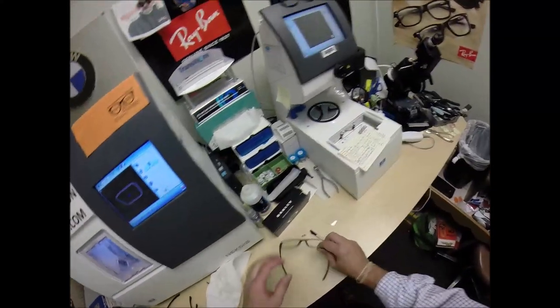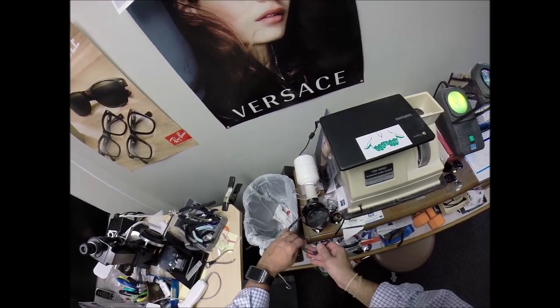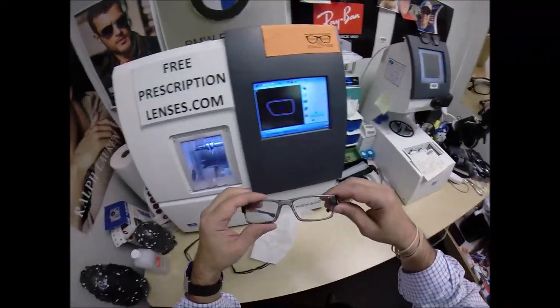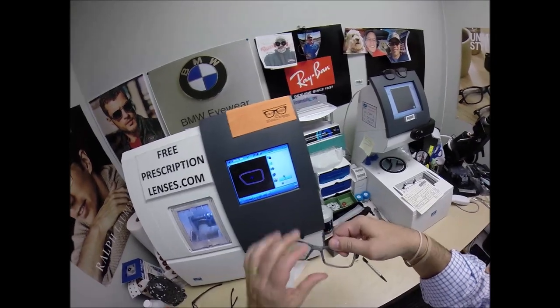A lot of optical shops use heat to adjust glasses. Now I do use this for the temples to adjust them. Of course you don't need to on this frame, but on others. But I don't like to use it on the frame front. I do everything known as a cold mount. If I were to force the lens in there, it would cause the frame to stretch or to roll.